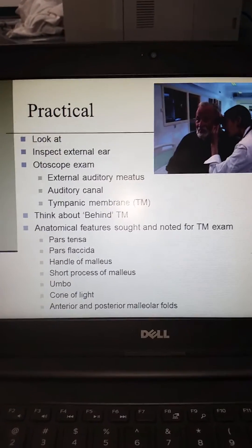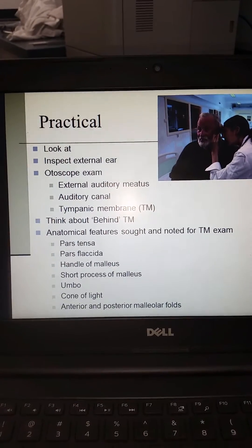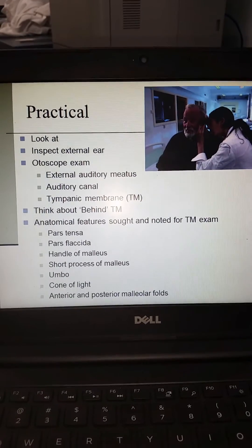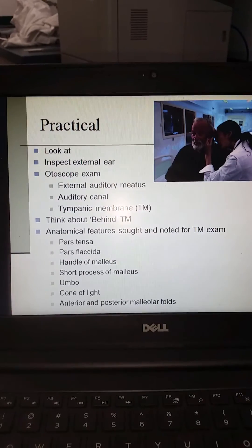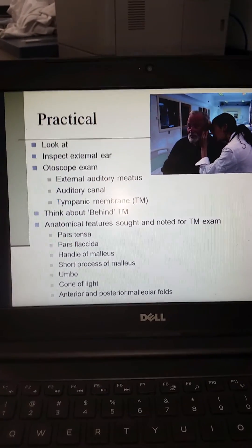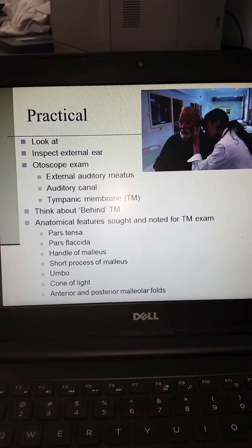To review for the practical portion of this ear exam: we will look at and inspect the external ear. Auditory examination of the auditory meatus, auditory canal, and tympanic membrane will be done with the otoscope. Remember that you may always move from the ear to the nose but never from the nose to the ear. Think about what's behind the tympanic membrane and remember those anatomical features: the pars tensa, the pars flaccida, the handle of the malleus, the short process of the malleus, the umbo, the cone of light, and the anterior and posterior malleolar folds.